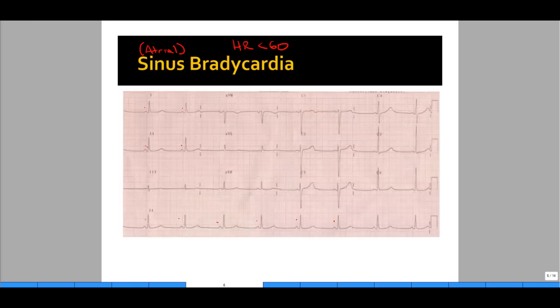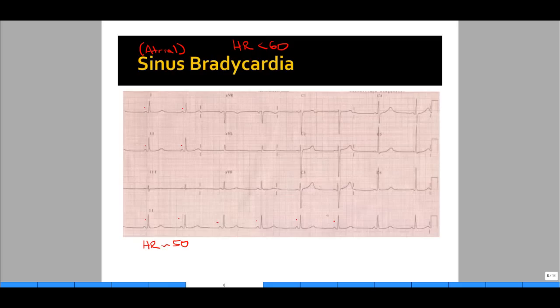The reason sinus bradycardia is important to identify is that you will do different things in different situations. If the patient's sleeping, blood pressure is okay, vitals are fine, and they're asymptomatic, sinus bradycardia may just be an incidental finding and there's really nothing to do. But you always need to know about the vitals. On the other hand, if the patient has sinus bradycardia and has developed hypotension not due to any other cause, you need to intervene.